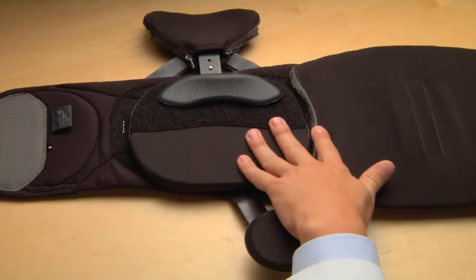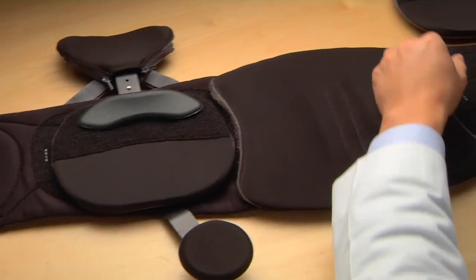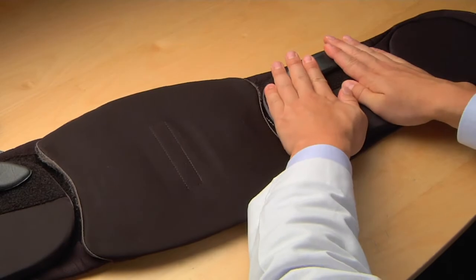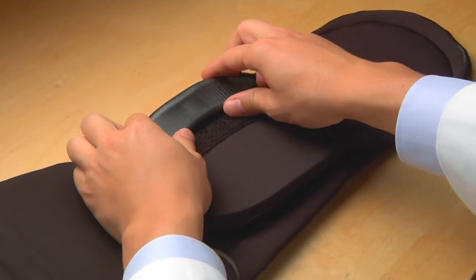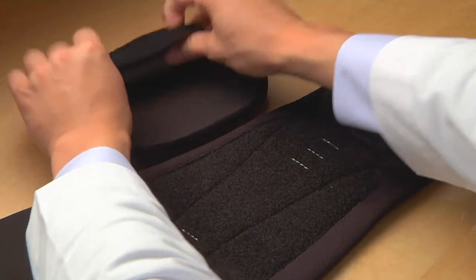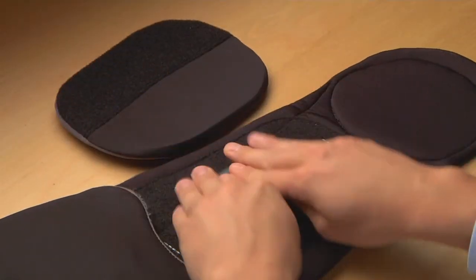Apply the lateral panel with the iliac pad to match the location on the opposite side and press down to secure. Note that iliac pads can be repositioned on the lateral panels or placed directly on the belt as desired to accommodate patient comfort.